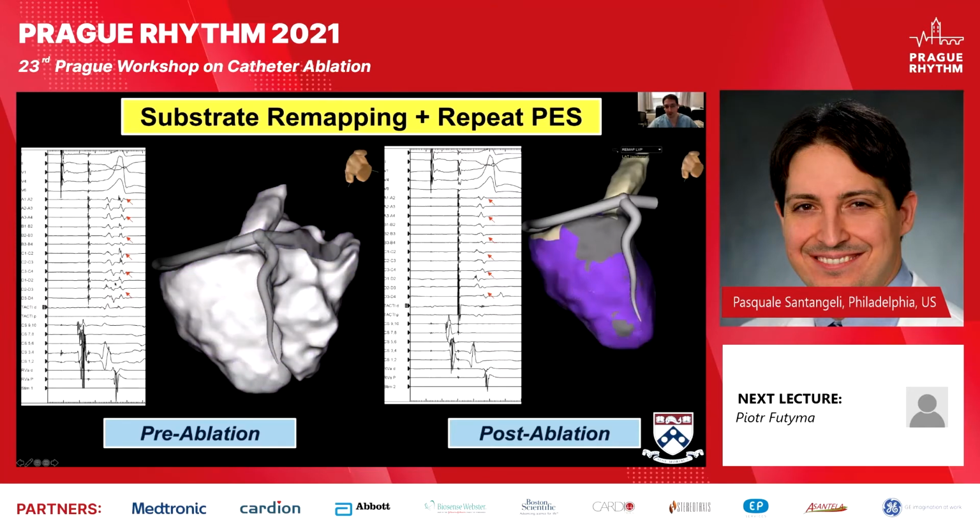And we're always watching the electrogram elimination on the multipolar catheter, as I explained before. After ablation, we see complete elimination of the abnormal electrograms. And here you see also the near-field propagation map with the complete elimination of near-field activation in this specific region. Following this, we do extend ablation empirically to other areas of a higher density of abnormal activity, which was the most apical aspect of the inferior substrate.